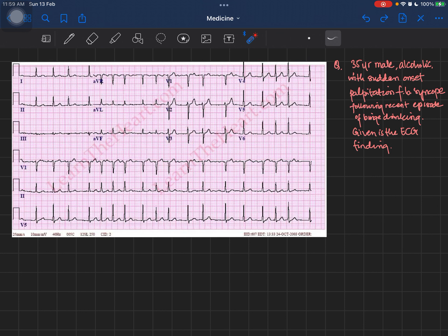The history tells us that this patient is an alcoholic, so there may definitely be some structural abnormalities in this patient's heart — for example, a dilated cardiomyopathy, which could be expected in an alcoholic patient. These structural abnormalities might be causing certain rhythm problems in this patient.